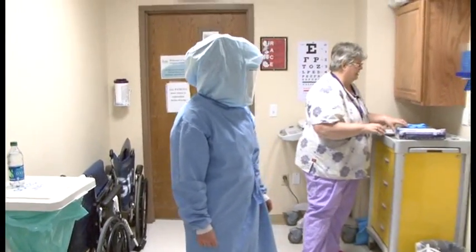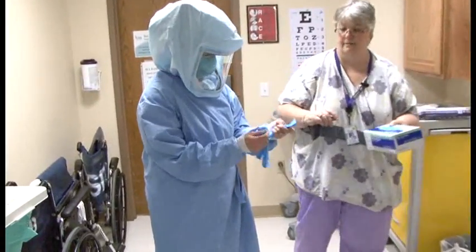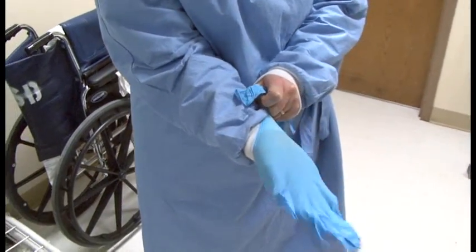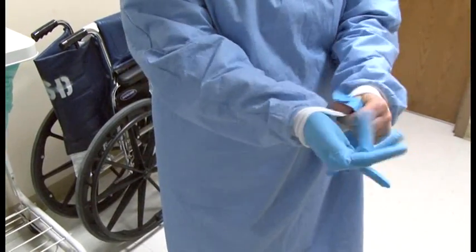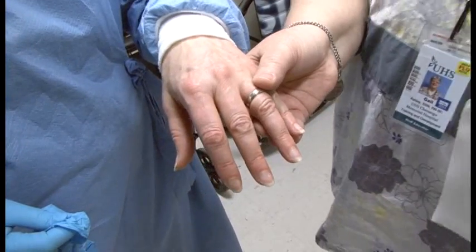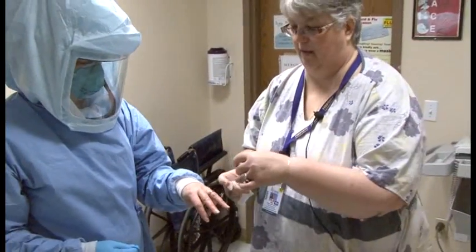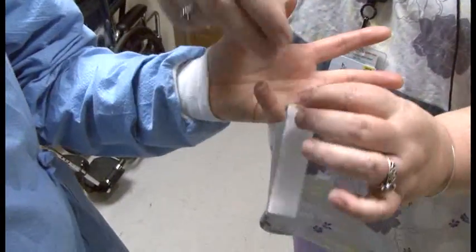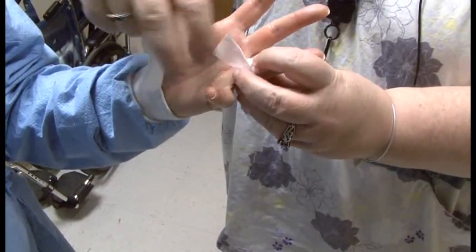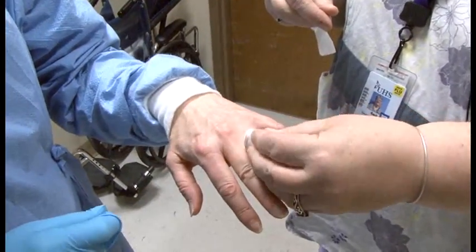Next to go on are gloves. Lynn puts on her first pair — regular nitrile gloves — with the gown cuff going over the nitrile glove. As you may notice, Lynn still has her ring on; she's had it on for forty years and it just doesn't come off. In that event, you are going to tape it. Bands aren't as much an issue as stone rings — you would not want to go in with any kind of stone ring because it can catch on your gloves and put a hole in them.